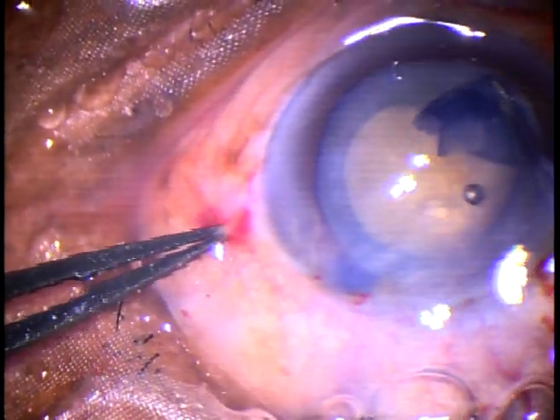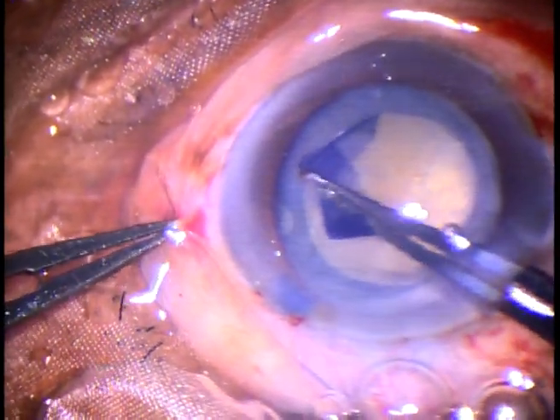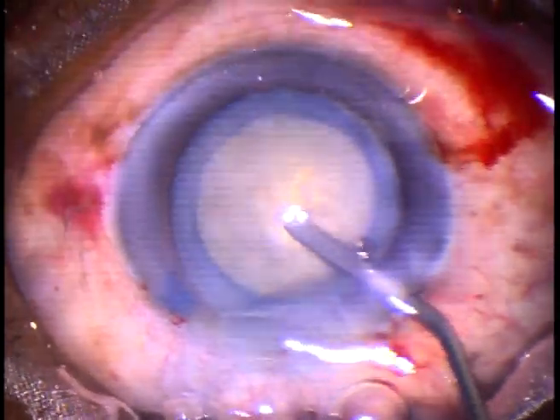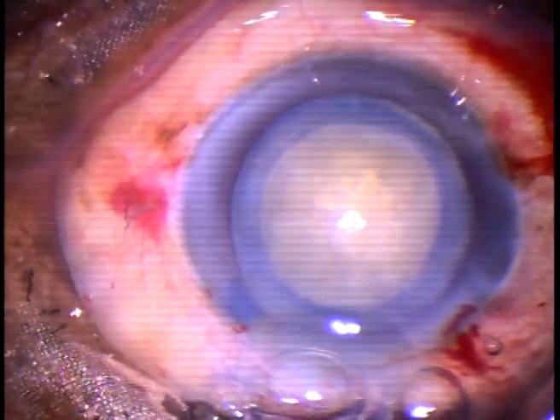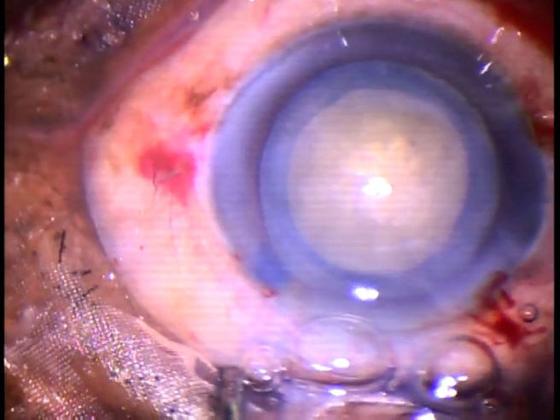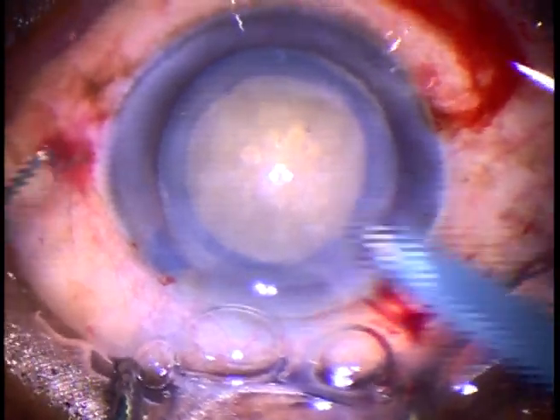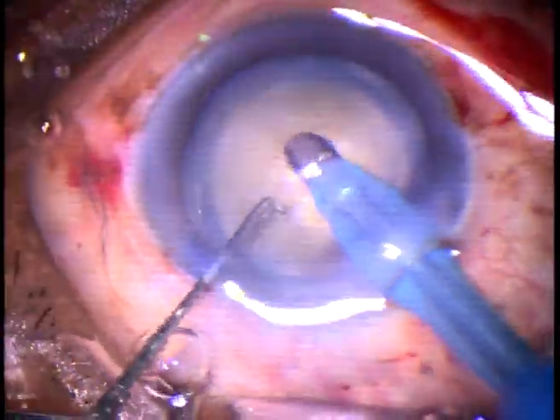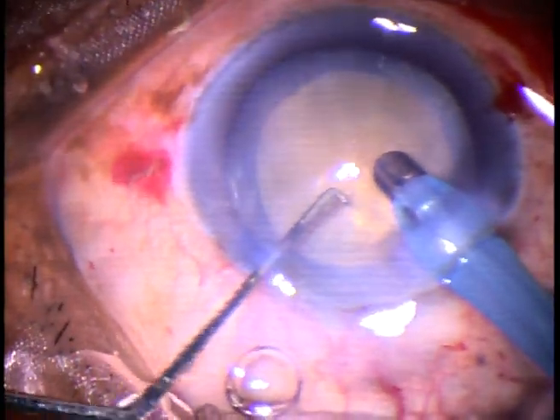The nucleus is quite hard in this case. So the rhexis should be of this size — about 5.5 to 5.75 mm in diameter. Visco has been injected into the anterior chamber. This is a free-floating nucleus. If we try to make a trench or try to hold this kind of nucleus with bevel up, we cannot do that. So the idea is to make a tunnel with bevel down.